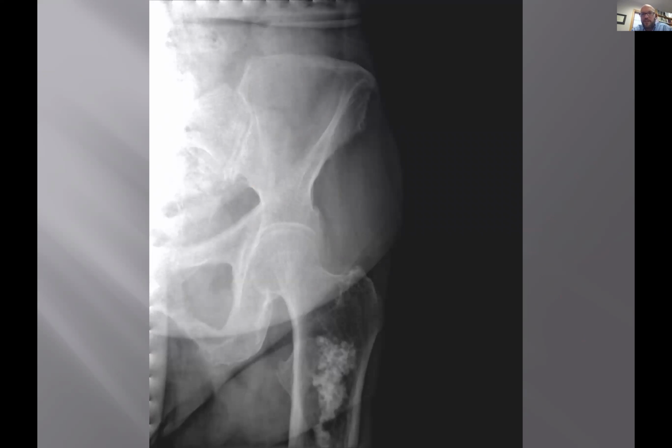All right, so it's kind of like in Tommy Boy, right? You know, where does it hurt? My face hurts. Where does it hurt? Well, not so much here, not so much here, more in here. Again, there's nothing going on in here. Wow, there's the finding. But here's the important piece of information. Of course, you're poking it and prodding it and asking questions, but there isn't any pain there.